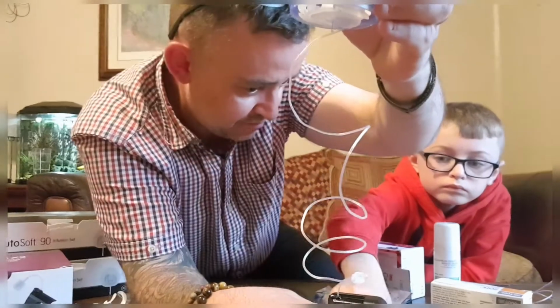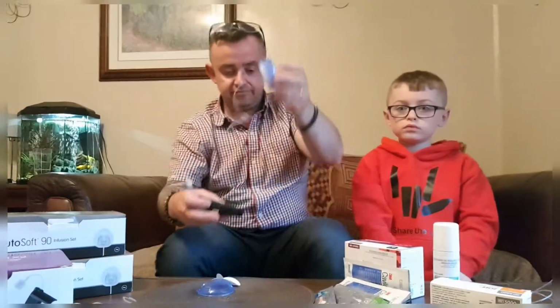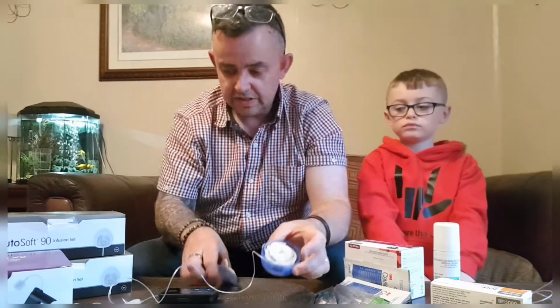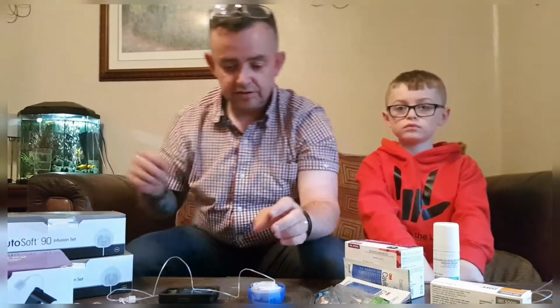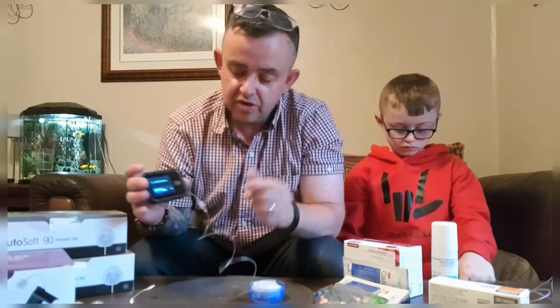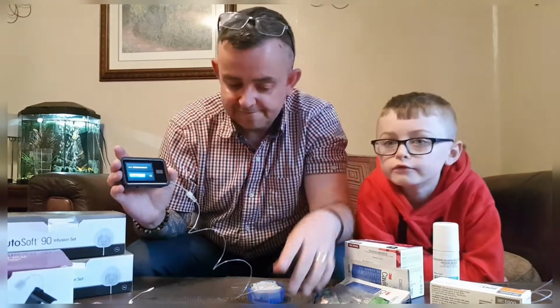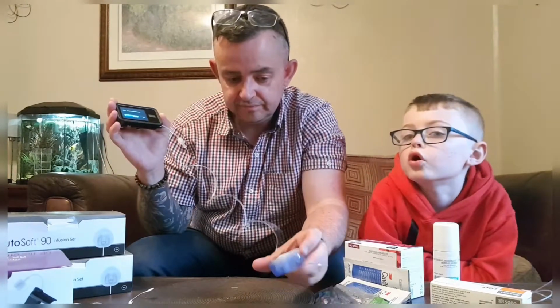There's 3. Press stop. There you go. Brilliant. So, detecting insulin. This part doesn't take that long. No, it does not take long.